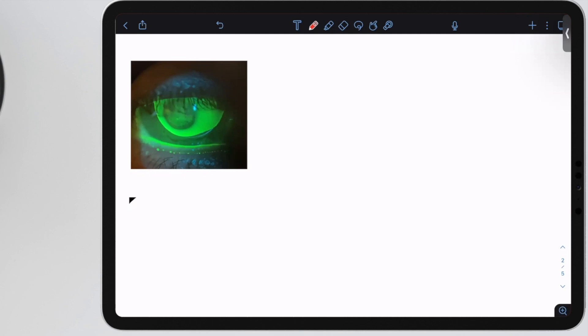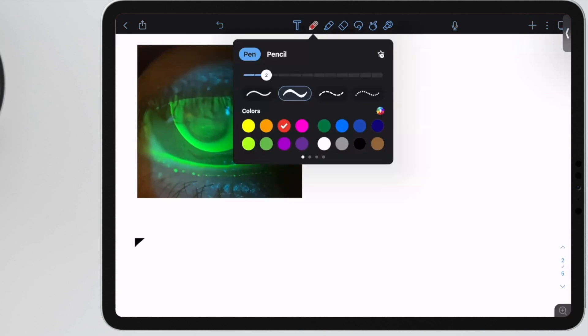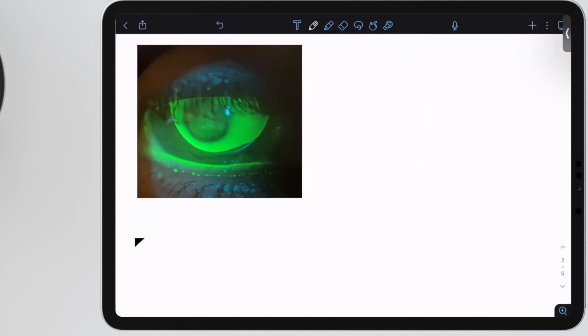What's going on here? Yeah, you're seeing some pretty gnarly central SPK. If you look really close, you'll see where this bottom edge is completely lifted off the eye and you're getting little air bubbles in there.